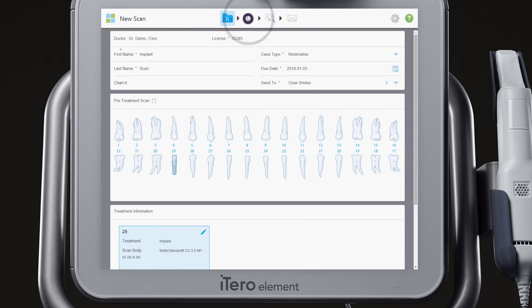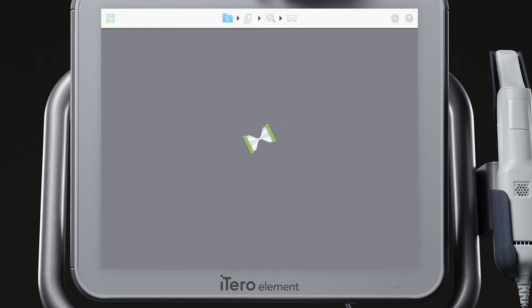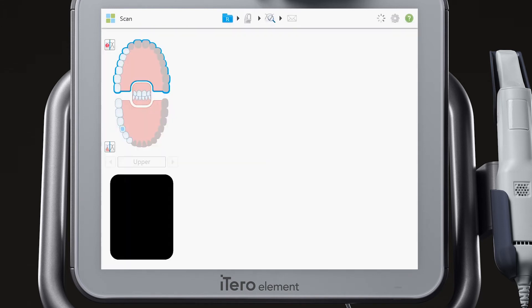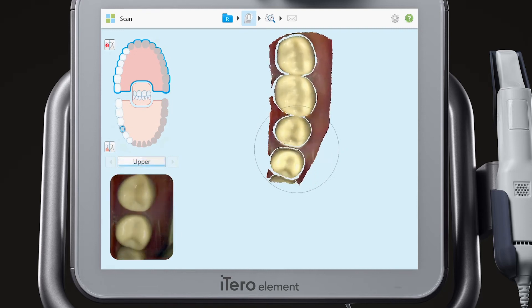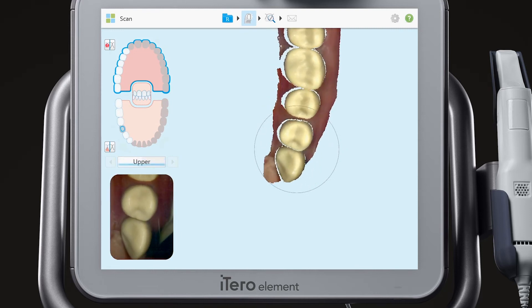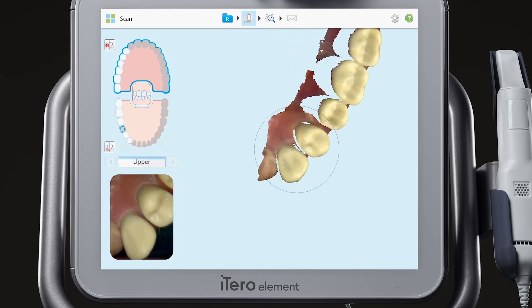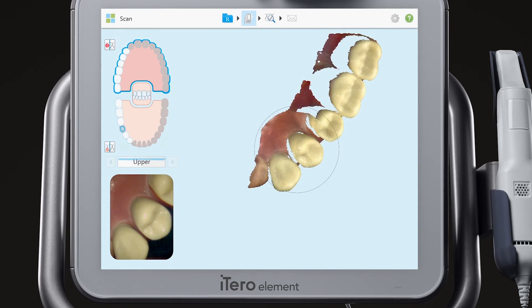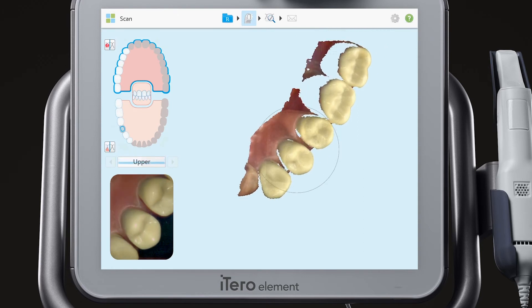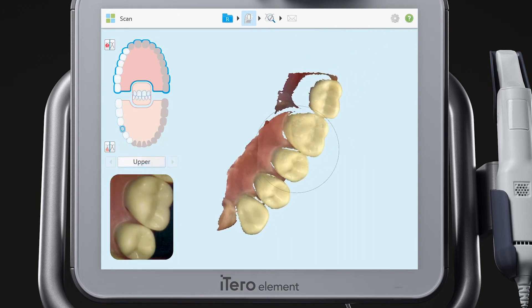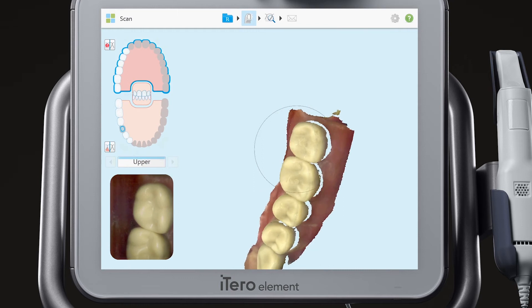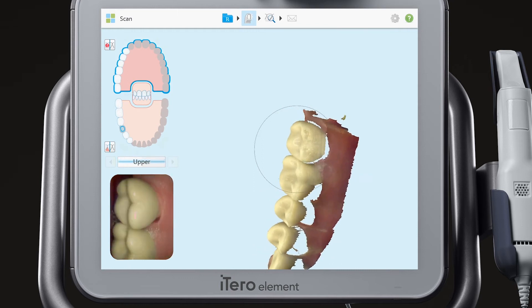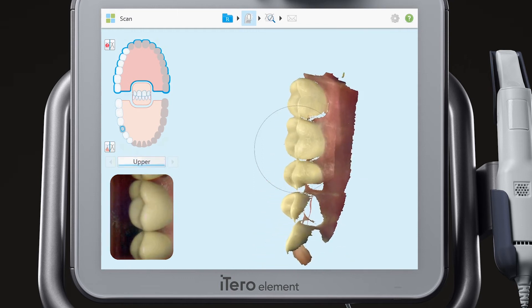Scan with the same scan protocol you would use for a single unit prep. First, scan the opposing arch occlusal, lingual, and buccal.